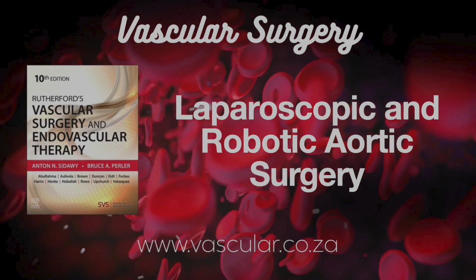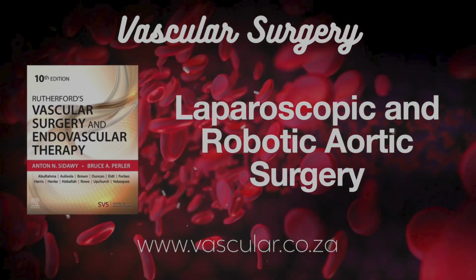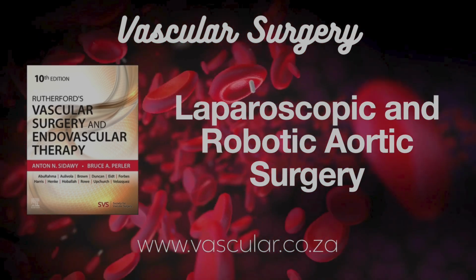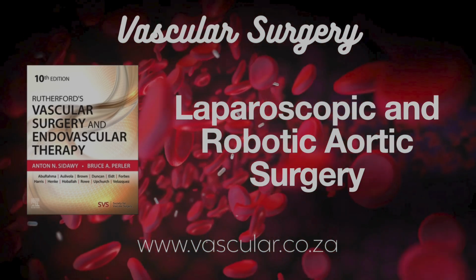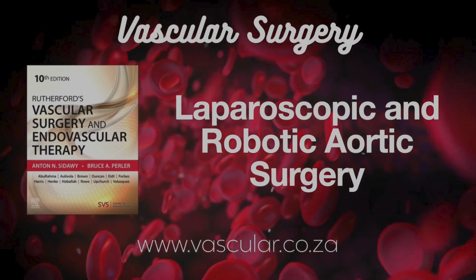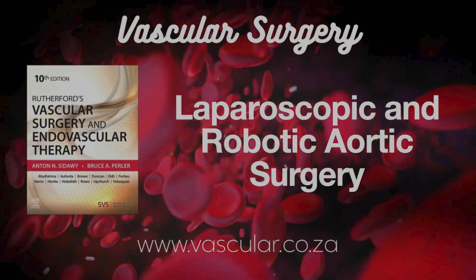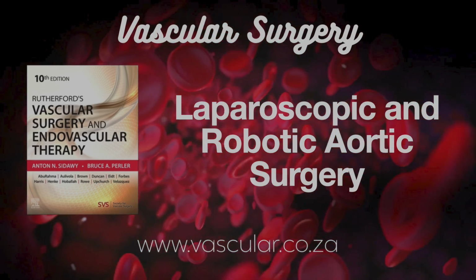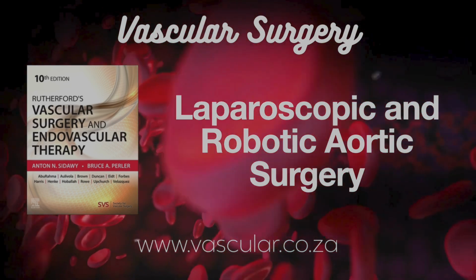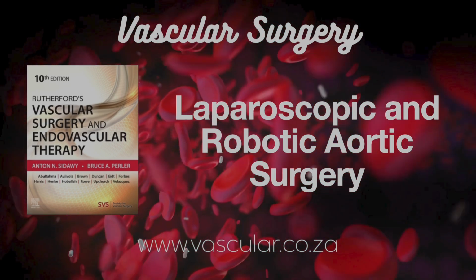The last one is the retroperitoneal approach. This involves a small cut, more like a mini laparotomy. So not just keyholes. Not entirely. You make a small cut, then dissect behind the main abdominal cavity in that retroperitoneal space. But the book notes it's not used as much. Why is that? Mainly because the working space is just smaller back there. And also, the CO2 gas they use to inflate the belly for laparoscopy can leak into that space and make it even tighter. So it can become quite cramped. Yeah, more confined. So less popular overall.